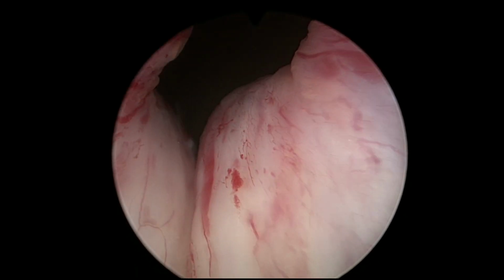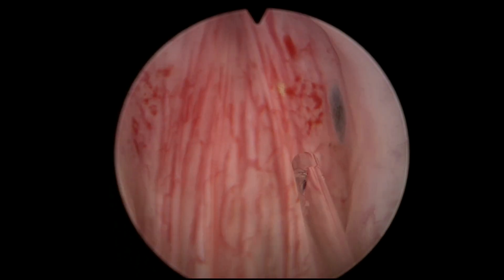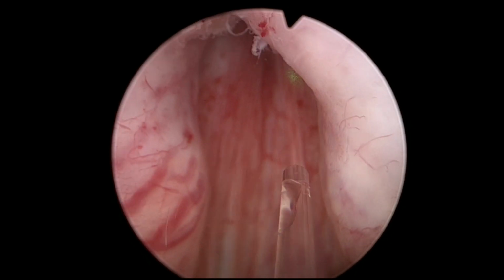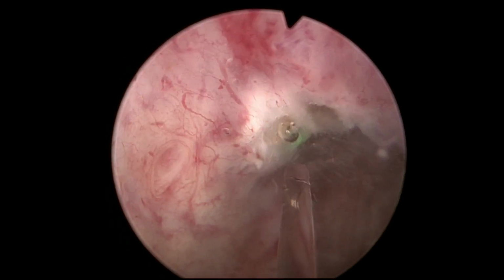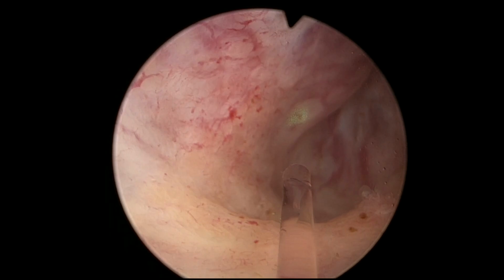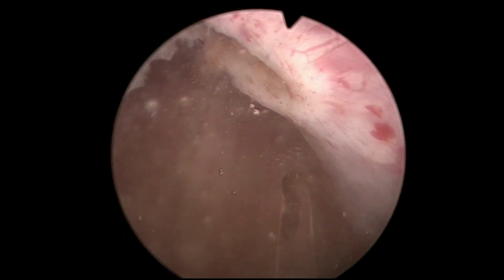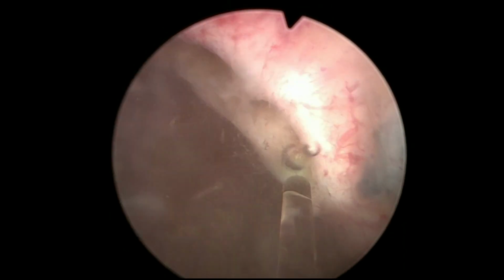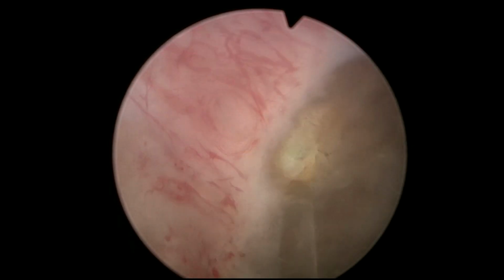So this is a man with a mid-sized prostate, not so small but not so big, and that's the contour of the sphincter, and you will see how when I fire this laser, the tissue effect is a little bit different. Basically, this laser is going to emit pulses that are a little bit longer than pulses emitted by holmium.